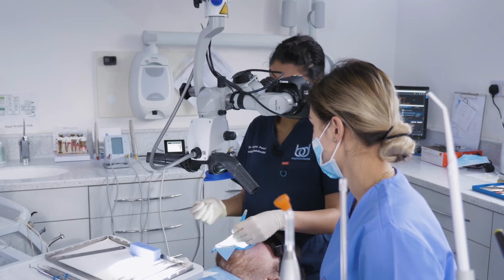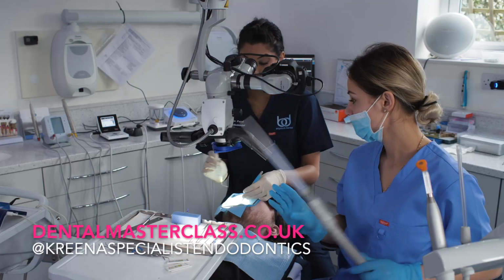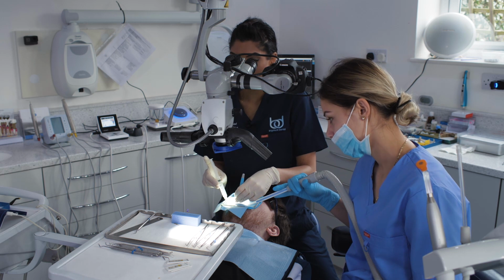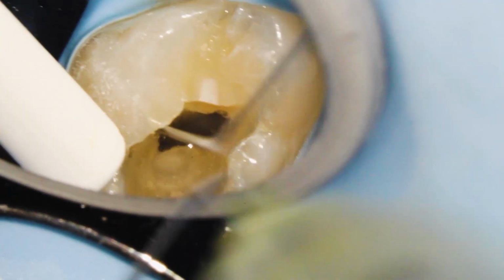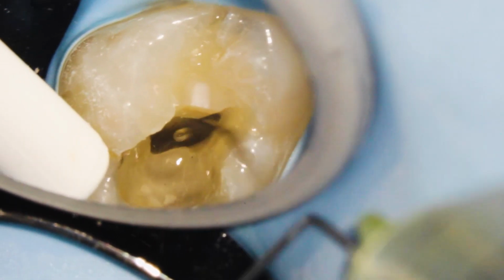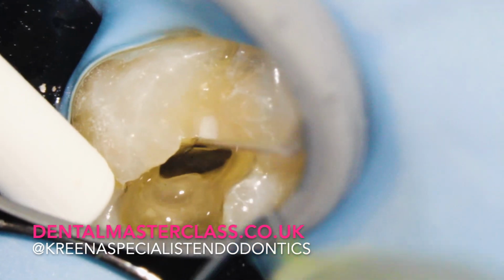And again, we want to make sure we flick them out. Normally I flick them out using ultrasonics, which are really good just to make them mobile and flick out. Then before we take any files into the pulp chamber and into the canals, we really want to flood the coronal aspect of the pulp in with sodium hypochlorite to disinfect it, because otherwise we can push bacteria up into the canals, which can result in a flare-up for the patient after the treatment.